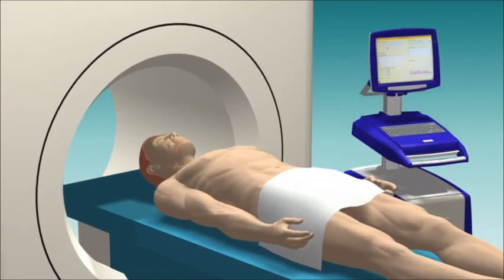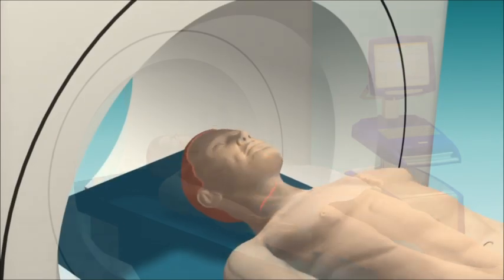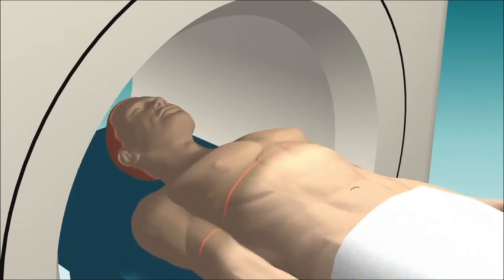The NanoKnife procedure is minimally invasive and is performed under general anesthesia with ultrasound or CT guidance.